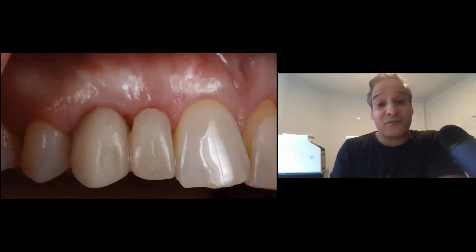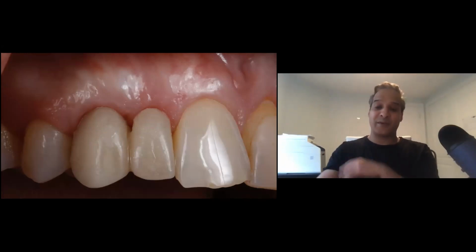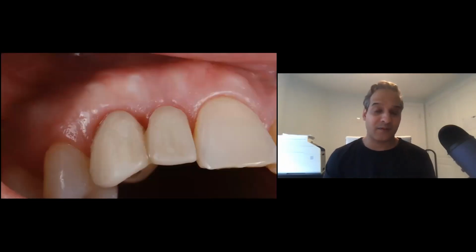This is after it has been matured. So you can see now the shaping and the papillas look good. And this is the best part. You can see the coronal, I guess occlusal, angle. You can see all of that thick tissue, the profile, everything is perfect. There's no deficiency, no indentation.